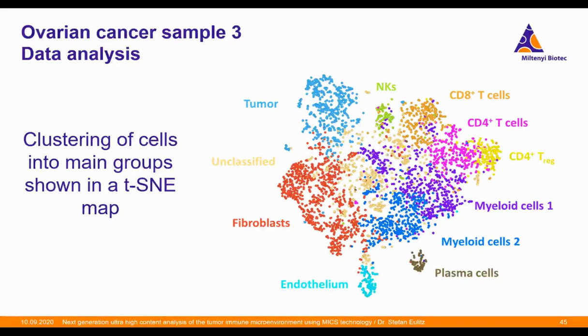When you have extracted the data, there are many different ways to analyze it. You can use our QI tissue software, but since the data table can also be exported, any type of analysis is possible. Here the result of one option is depicted. In this case, the cells were first hierarchically clustered, which is not shown here, and then the main groups of cells were determined based on the expression patterns and given a color.